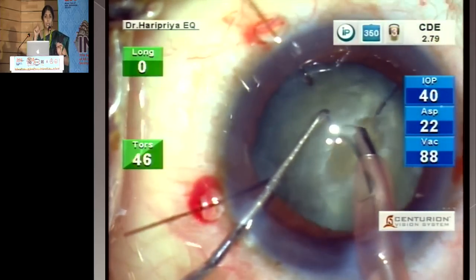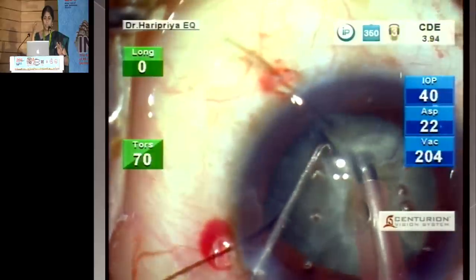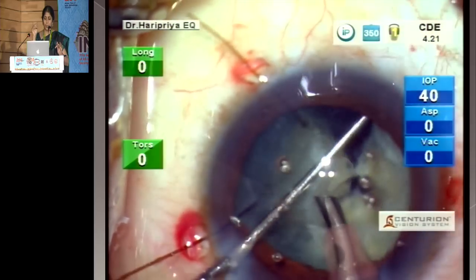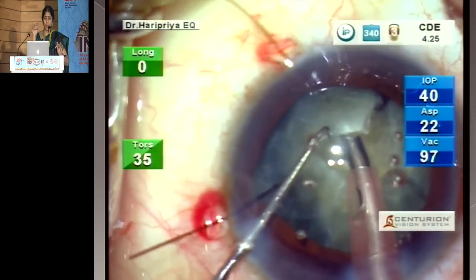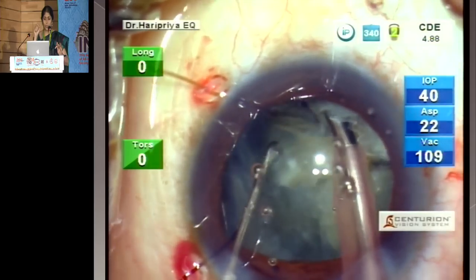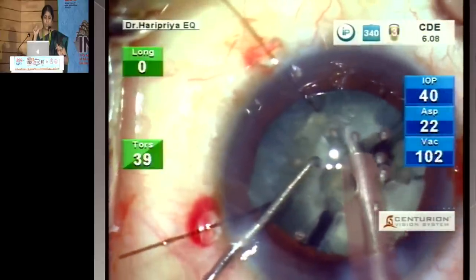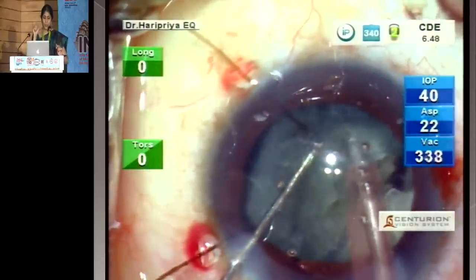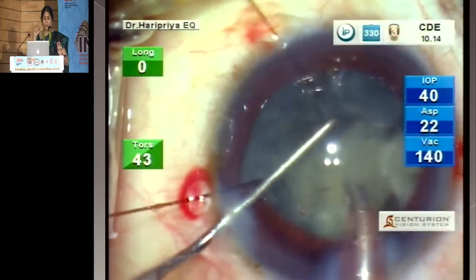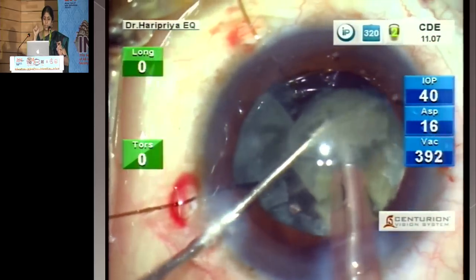If you have very low parameters and it doesn't cut, then you're probably going to use more fluid, which will hydrate the vitreous more, increase your positive pressure, and make the whole procedure more difficult. So with these low parameters, you can see how effective it is for cutting. Have a good hold on the lower half, and gently separate it all the time, being aware that the zonules are weak. Also try to avoid any movement of the phaco tip at the side where you have the zonular loss. The fragments are broken into as small pieces as possible.